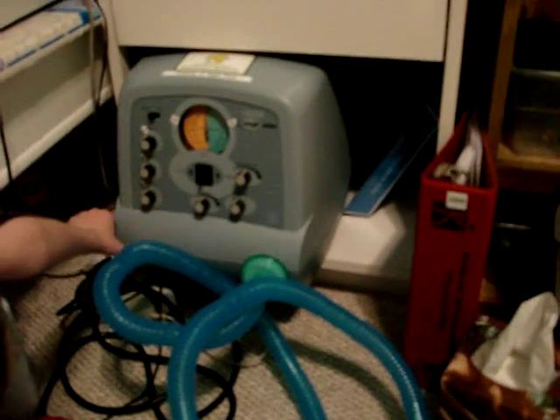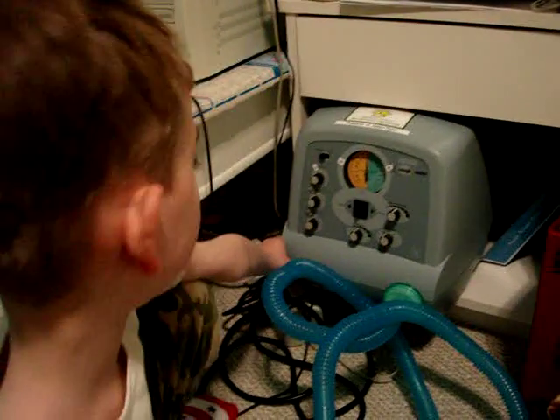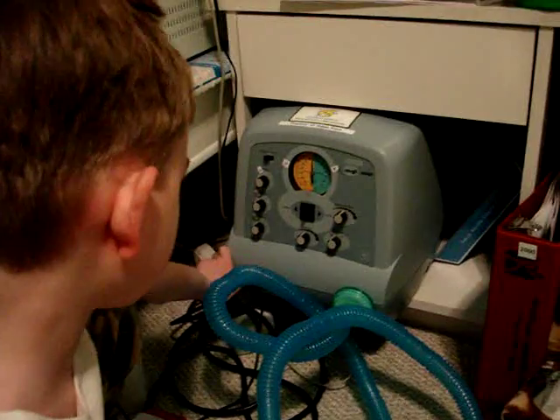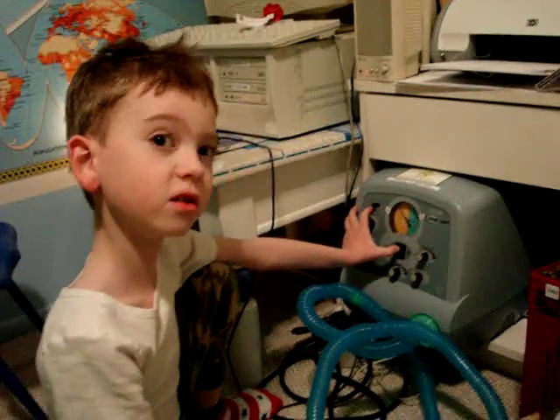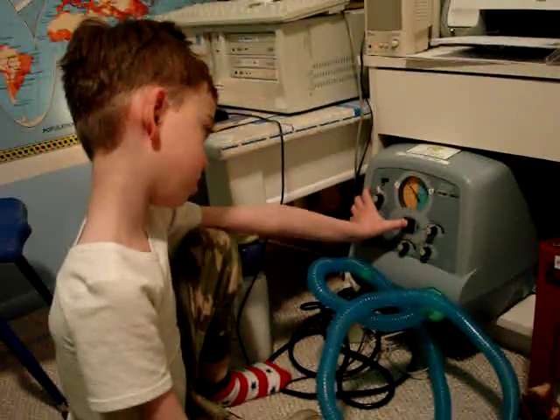He has a stuffy nose, so he's going to show us how he clears his nose. He turns the machine on and then presses the exhale button, which is where his thumb is right there.